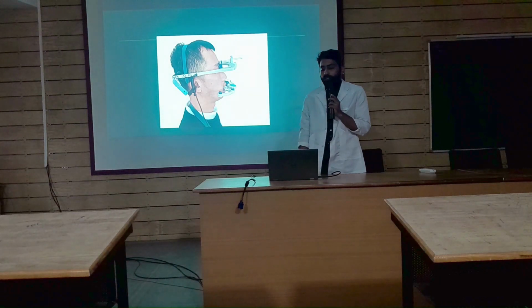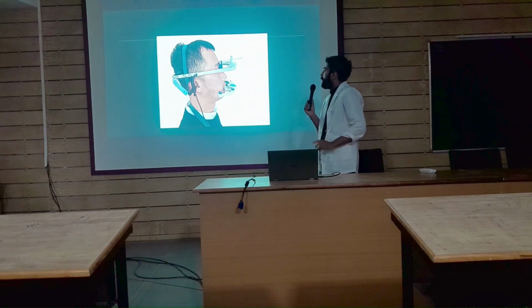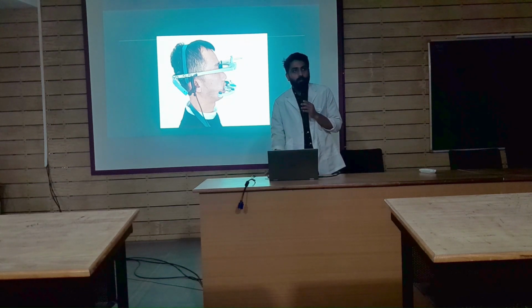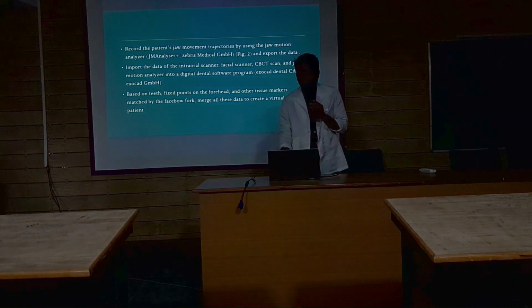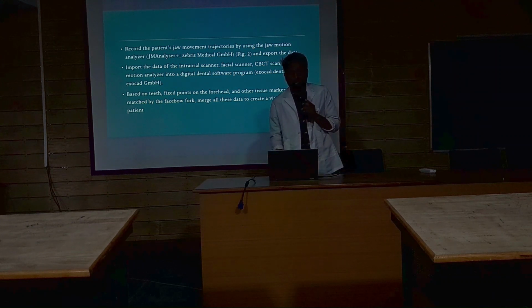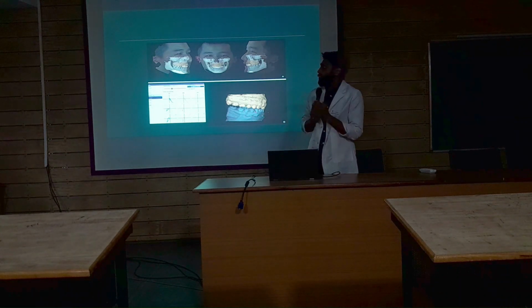So we have done all the scanning, and now we use a device called the jaw motion analyzer. This instrument helps us to identify the mandibular movements, the movements that take place when the patient moves the mandible. So we record the jaw movements. Then we import the data of the intraoral scan, and then we import all these data into a dental software program. Based on teeth, fixed points on the forehead and other tissue markers matched by the facebow fork, we merge all these data to create a virtual dental patient. So this is the virtual dental patient.